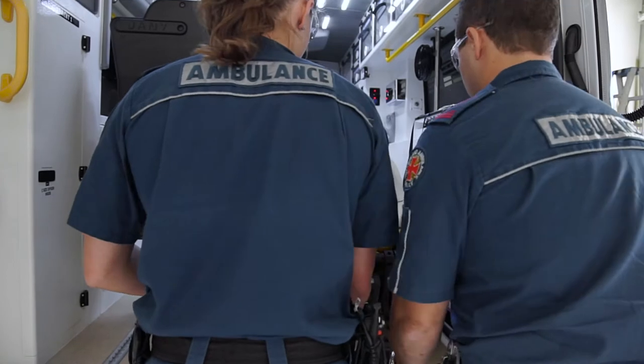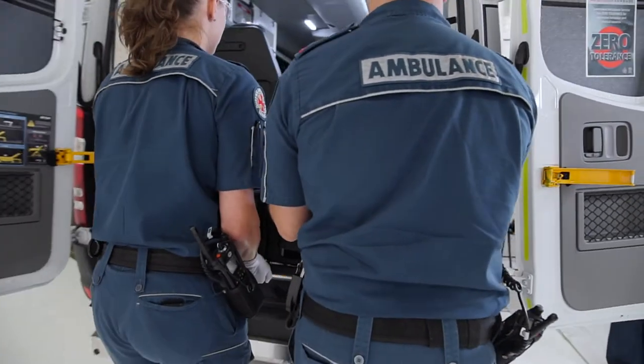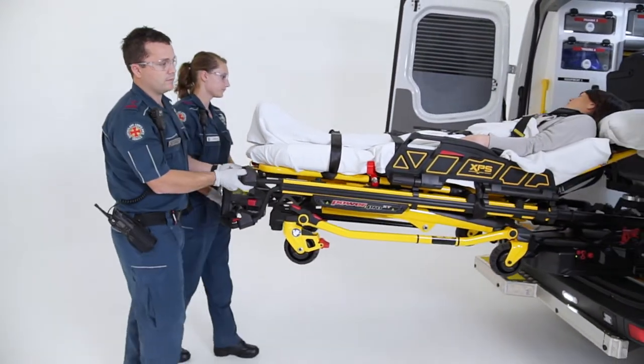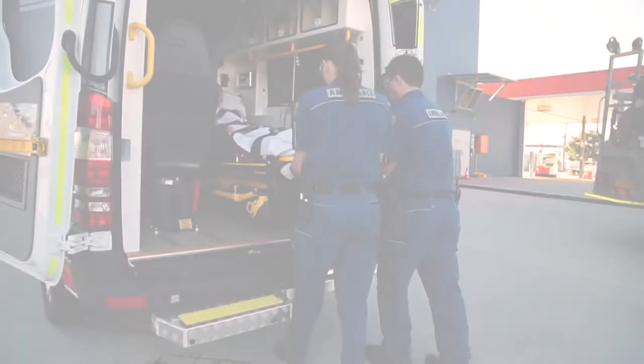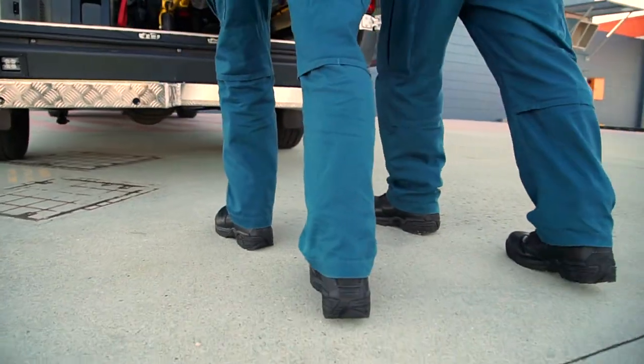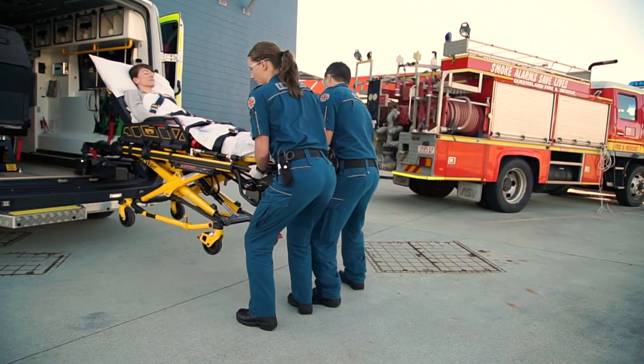The PowerLoad system is designed to assist the user when lifting or lowering the stretcher and patient into and out of the ambulance, reducing spinal loads that result in cumulative trauma. It reduces the need to steer the stretcher into and out of the ambulance and minimises patient drops by supporting the stretcher until the wheels are on the ground.